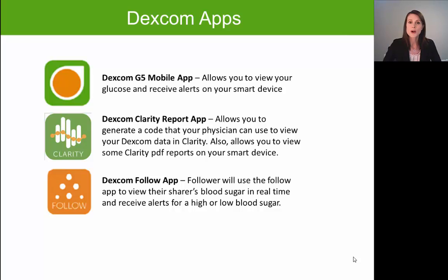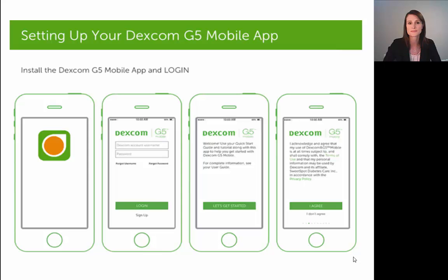We do also have a list of smart devices that are compatible with these apps on our website under FAQ. But let's first discuss how you're going to set up the Dexcom G5 mobile app.